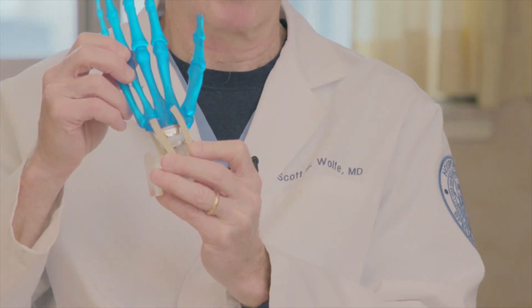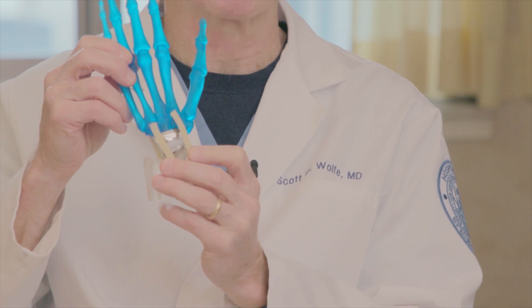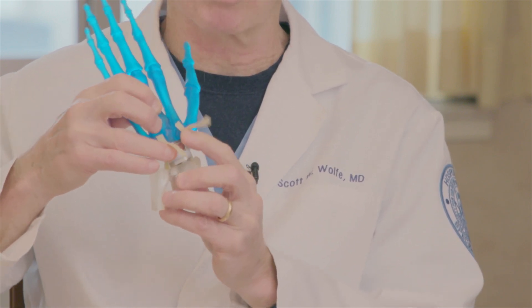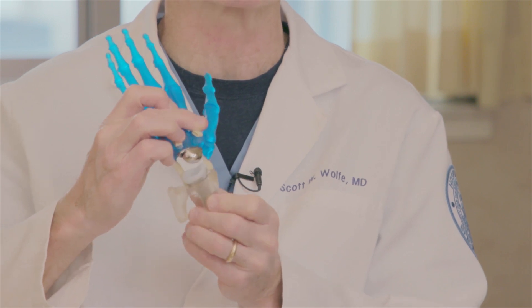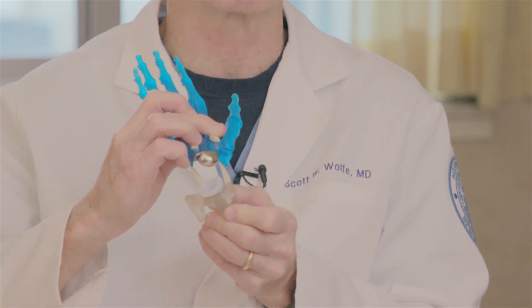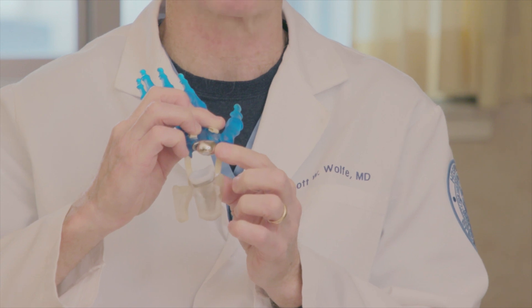This is a model of the implanted wrist. The straps that I'm holding down with my fingers are actually the ligaments. I've done it that way so that we can remove the ligaments to expose the carpus itself. You can see that there are two implants — one that's in the radius and the second one that's in the carpus.